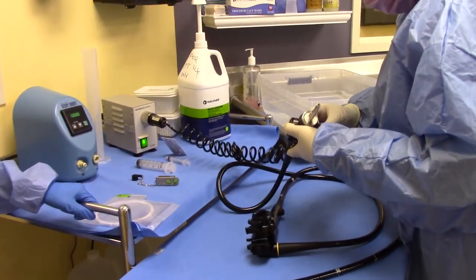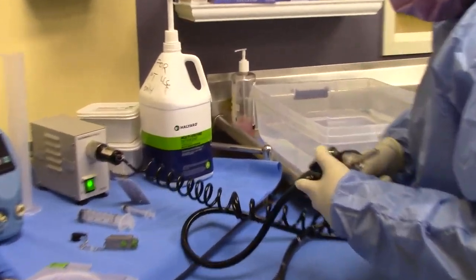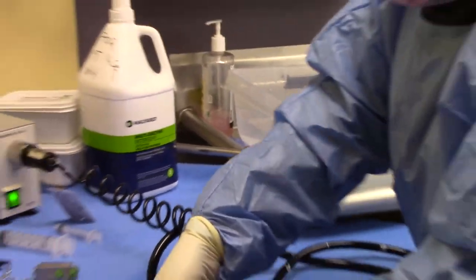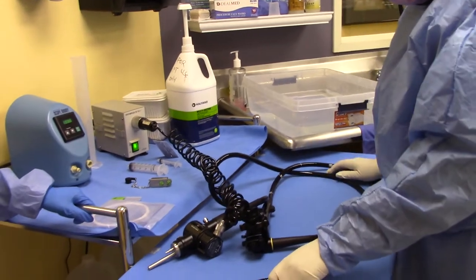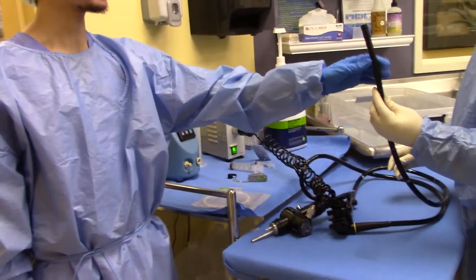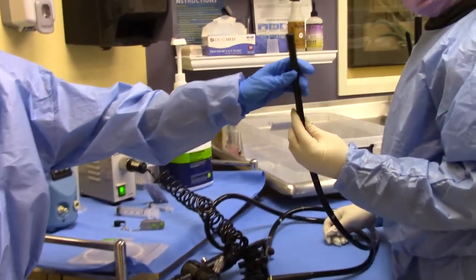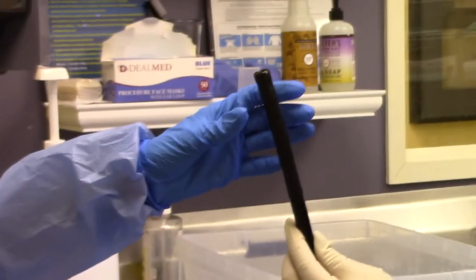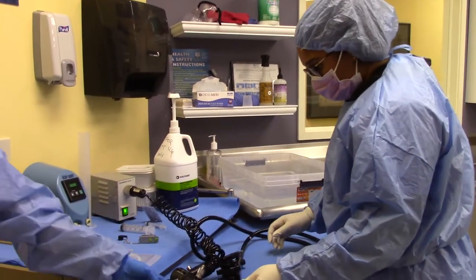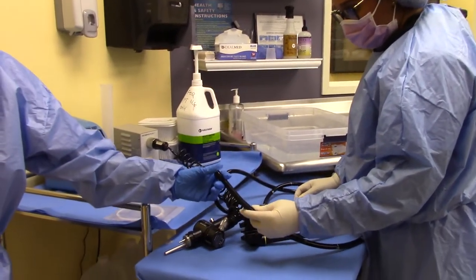Next, she will connect the endoscope with the leak tester. It is now properly connected and secure. To tell that the endoscope is properly connected with the leak tester, you will see the distal tip of the disc stretching out and growing a lot harder. Also, you will be able to feel air coming out of the endoscope right here.